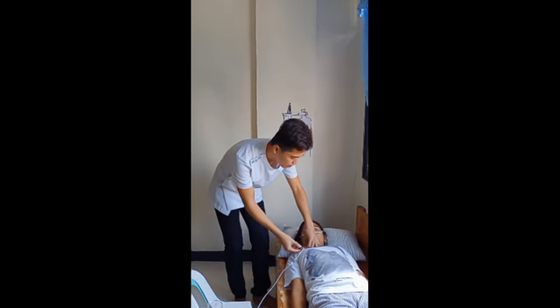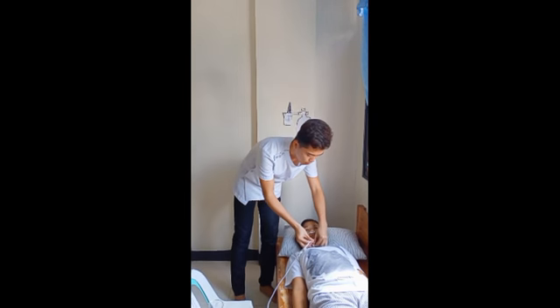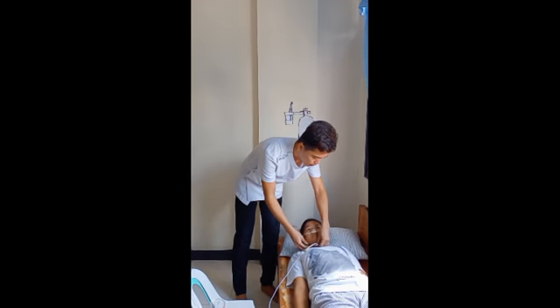So if you can see, this is the locking of the nasal cannula. You use this to lock the nasal cannula on the patient.